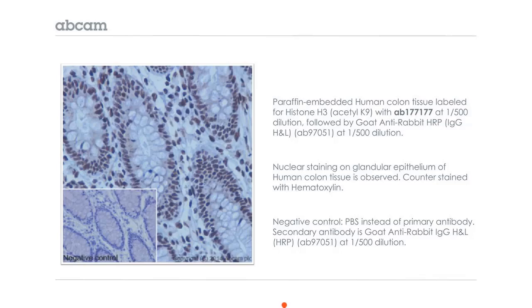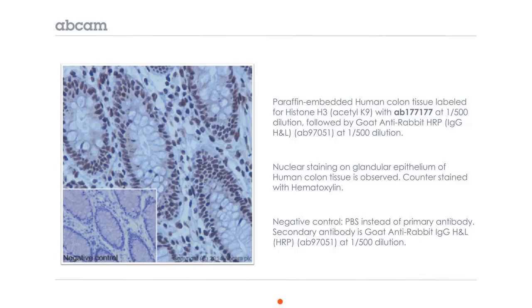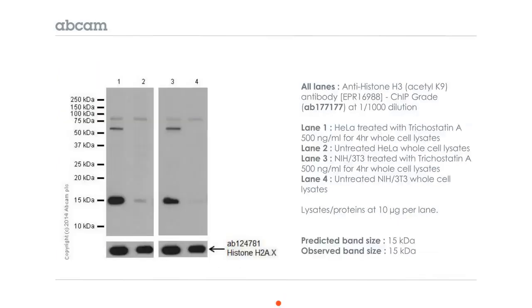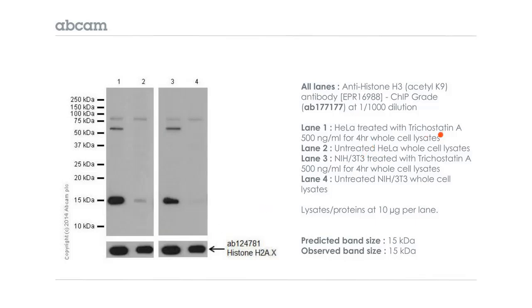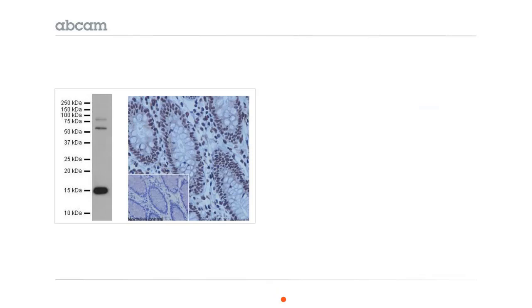But here's another antibody against a different target, histone H3, acetylated at lysine 9. And this is also showing nuclear staining, as expected. But in this Western blot, you have detection of other bands aside from the expected molecular weight of 15 kilodaltons for histone H3. You have some detection of these other proteins in lane 1 and 2. In this experiment, the cells were treated with trichostatin A to upregulate the acetylation. But in any case, the problem is that you don't know exactly which of these proteins is producing the signal in the nuclei here. It could mostly be the histone, but you have these other two proteins up here that could be contributing to that signal.